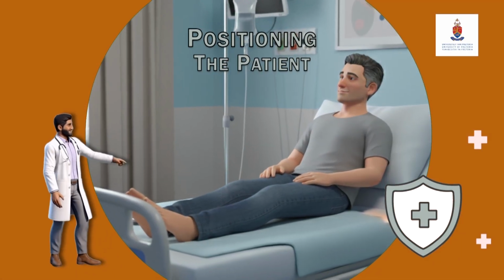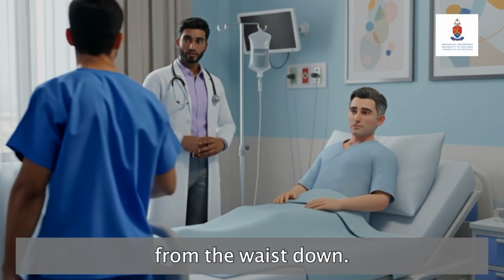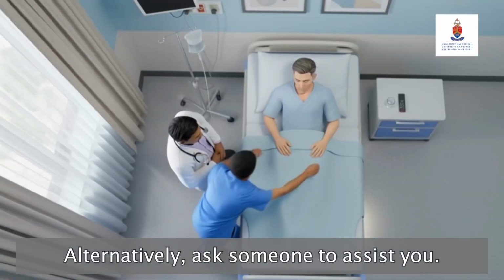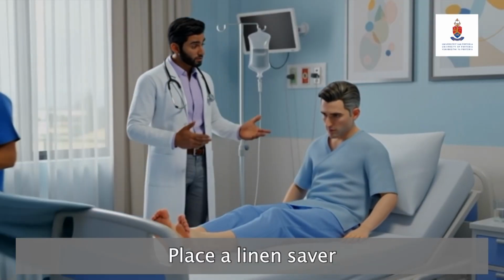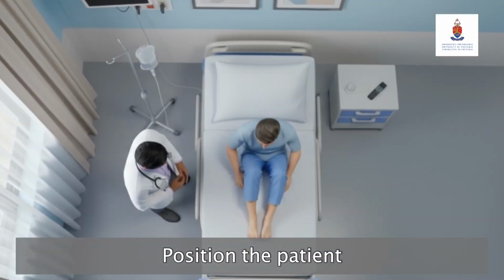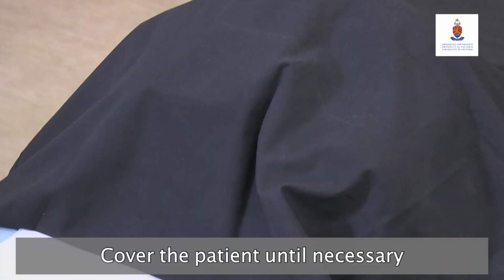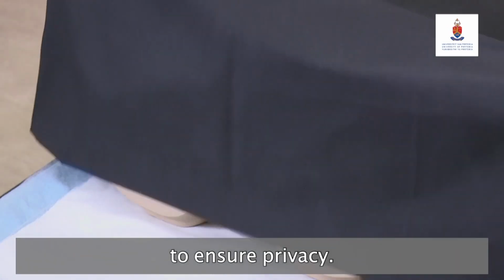Positioning the patient. Ask the patient to remove their clothing from the waist down. Alternatively, ask someone to assist you. Place a linen saver underneath the patient's buttocks. Position the patient supine with flexed knees and abducted thighs. Cover the patient until necessary to ensure privacy.